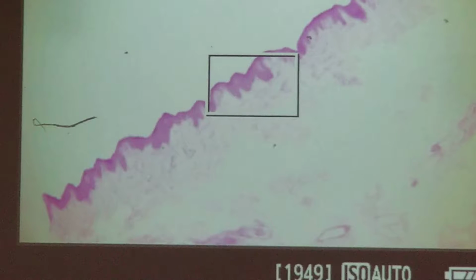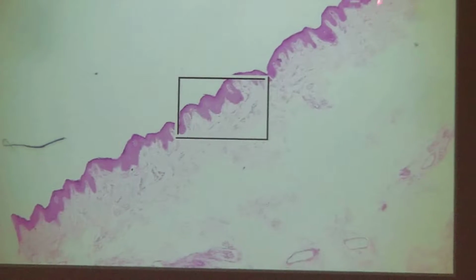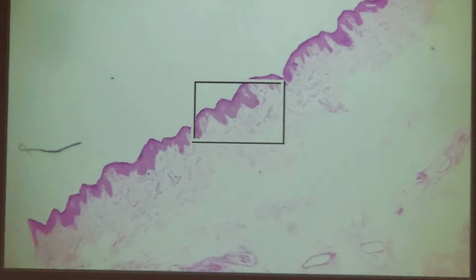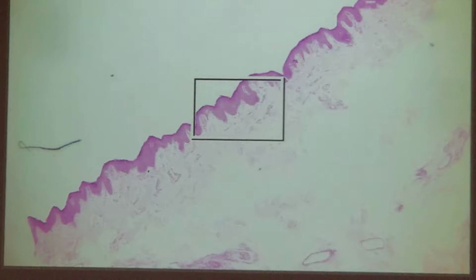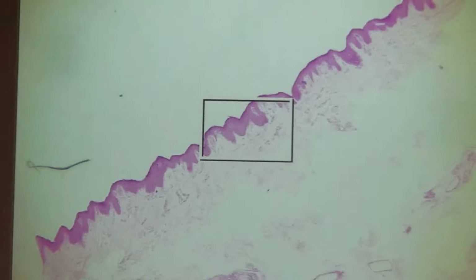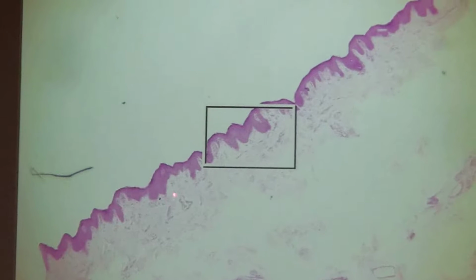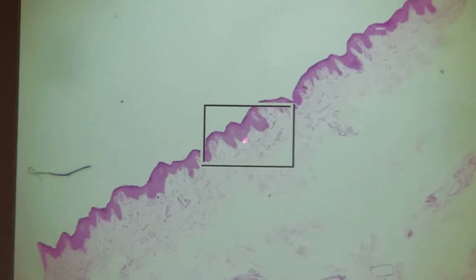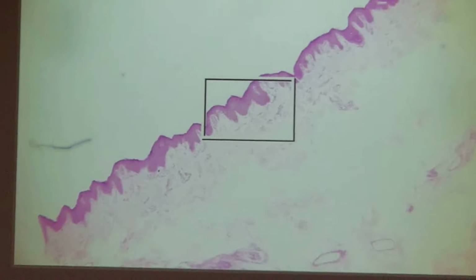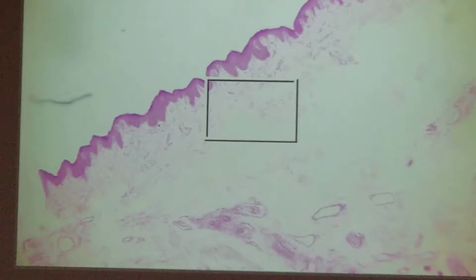that little lavender or purple ribbon up on top is what? Epidermis. So what kind of tissue specifically? What's the epidermis of your skin called? What type of tissue? Can't hear anybody, hold up, speak up. Stratified squamous epithelial tissue, right? Remember, you drew this the other night. So just beneath that, right here, I'm gonna take the box, that's gonna be dense irregular connective tissue.